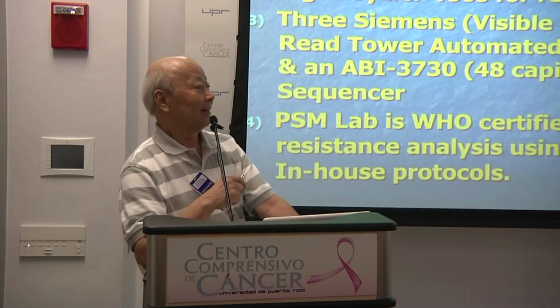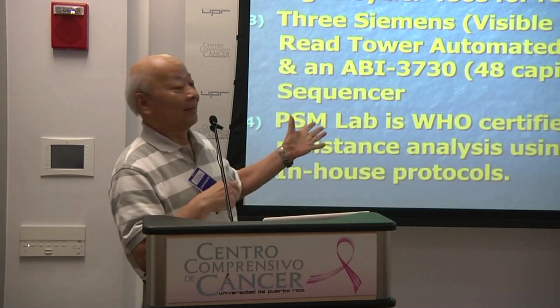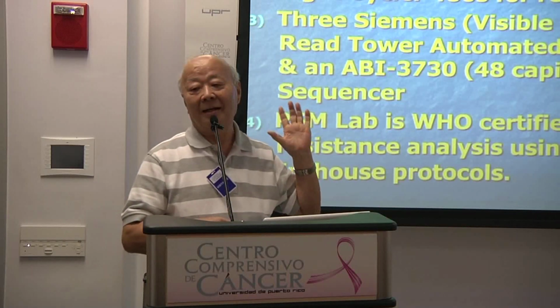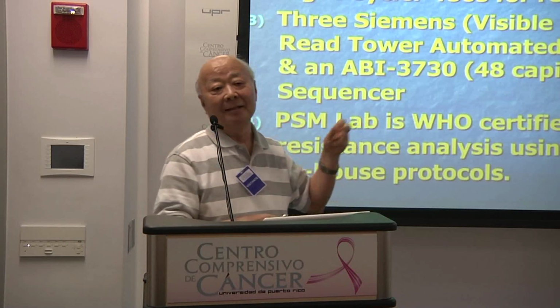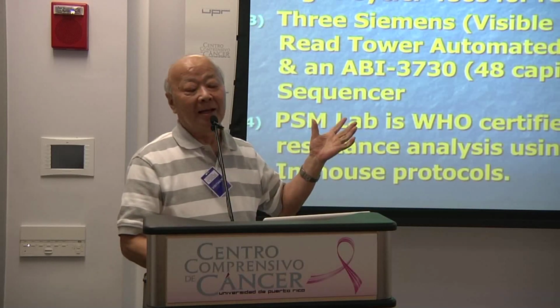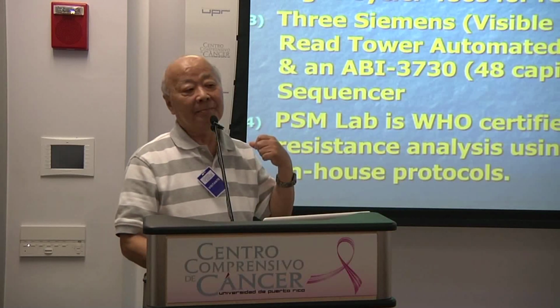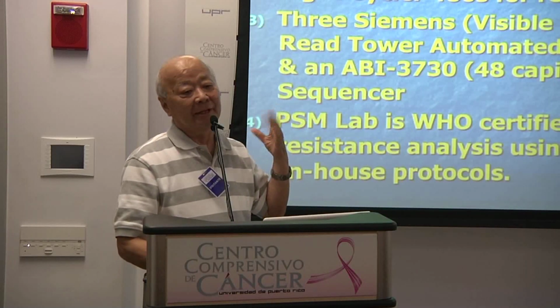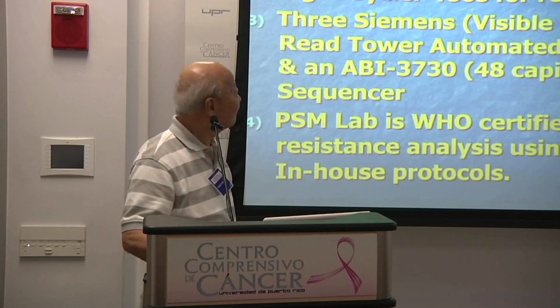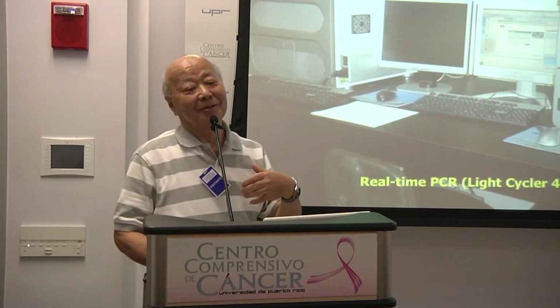we have not only the TruGene system, which is the FDA approved kit-based genotyping system, but we also have the homebrew system, the WHO accredited. I'm only saying that we're not that bad.